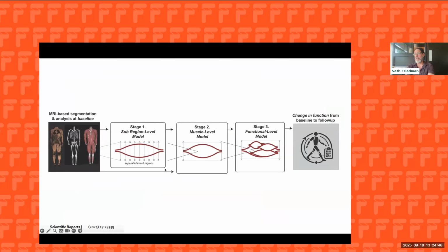The other thing that Sylvia did, as a biomechanical engineer who looks at muscle, is this: a lot of times my emphasis was always radiologic, and we've had a lot of neurologic focus in the disease as well, but I haven't had as much biomechanical focus in how to solve these problems. One thing that is super interesting about this model, and you'll see why it's so valuable, is that first the muscles are divided up into pieces. This allows you to boost your signal to noise in a small region that's changing over time. You can imagine in a larger muscle, if there's only a tiny blob of fat, it takes a lot of change to have sensitivity.